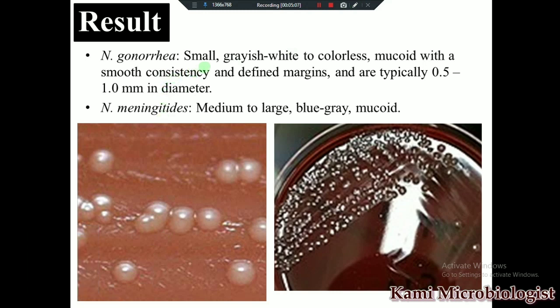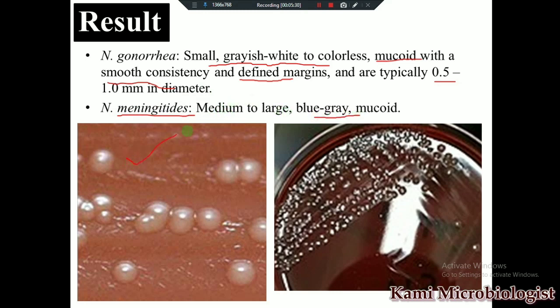These are the bacteria as you can see: Neisseria gonorrhoeae will show small grayish-white or translucent colonies with smooth consistency and defined margin, with a diameter of 0.5 to 1.0 mm. Neisseria meningitidis has similar colonies but they are medium to large, blue-gray in color. This is the Neisseria gonorrhoeae colony, and this is the Neisseria meningitidis colony.